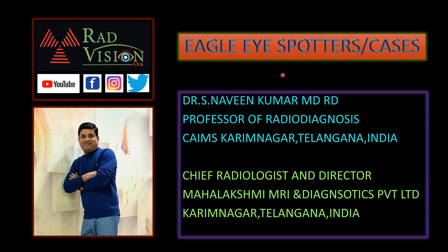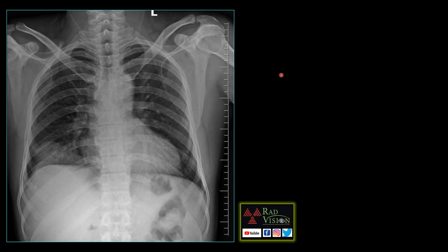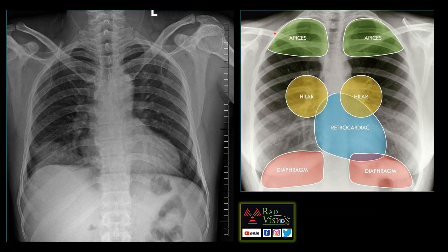Intentionally the history is not given. This is the first case. The patient presented with cough and chest pain. You can see there is a homogeneous opacity noted in the right lower zone just over the right dome of diaphragm. No other obvious lung findings and the cardiac shadow appears normal. Even the bones and soft tissues appear normal. We will try to see what are the hidden zones in the chest we have to screen so that we can come to the diagnosis.